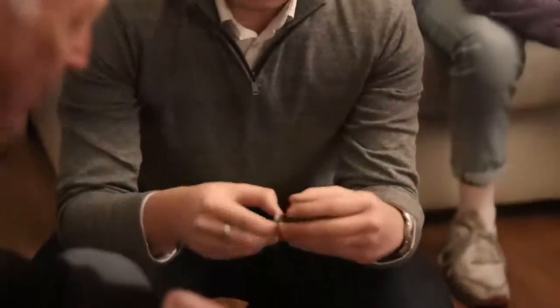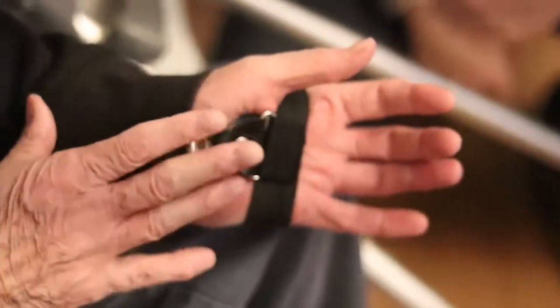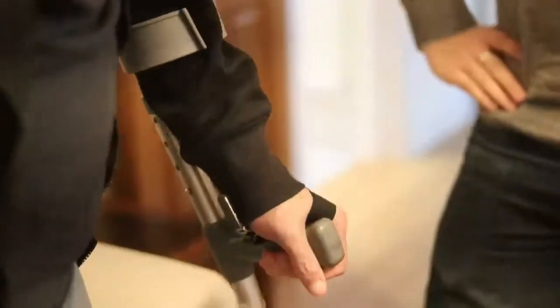So we took the product to Gerald with all the added improvements, and it turned out to be a very big success. He absolutely loved it. He was able to open the clips very easily, he adjusted the width of the strap, and his arm was easy to insert. The placement of the clips on his hand didn't hinder the grip for the crutch, and most importantly, it kept the sleeves down.